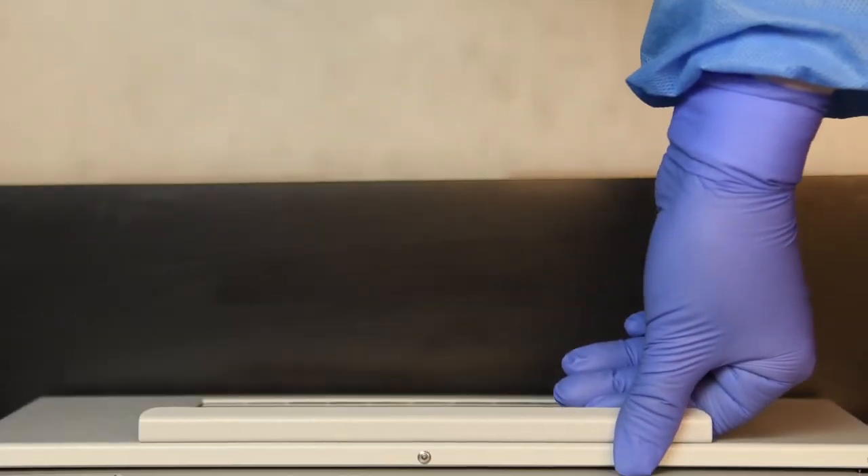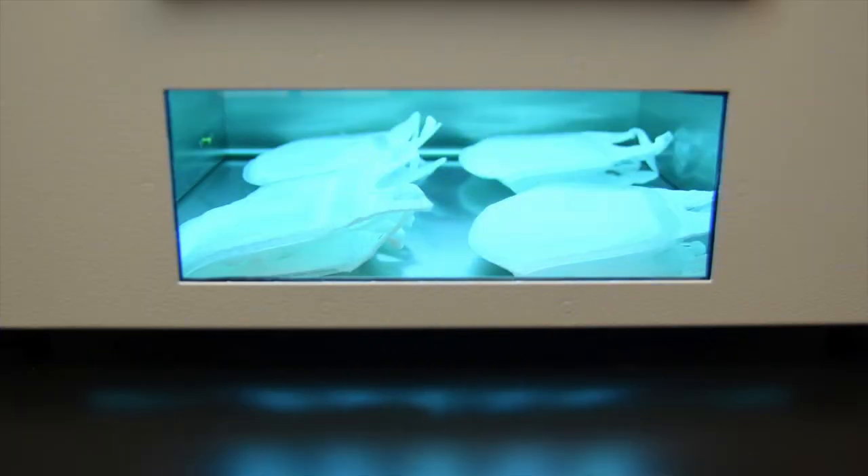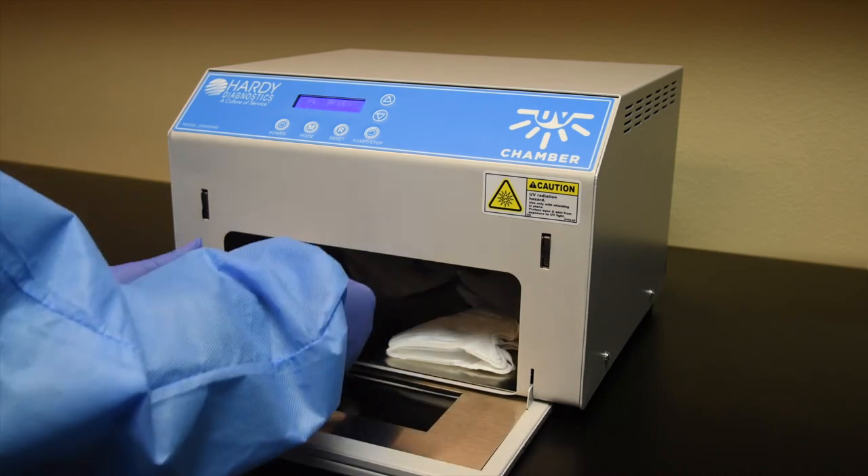Close the unit, then press Start again. When the cycle is finished, open the unit and remove the N95 masks.